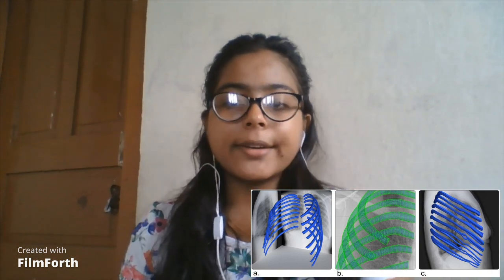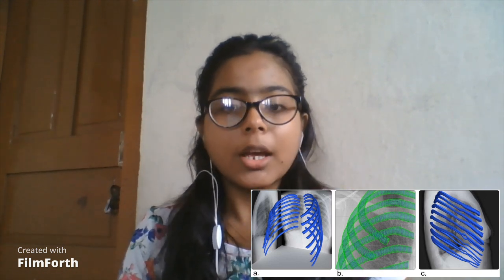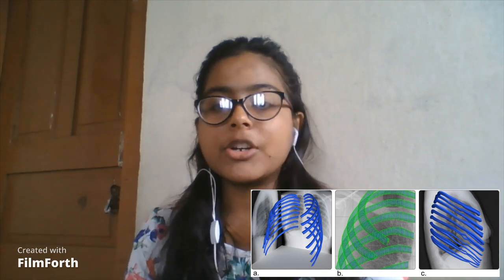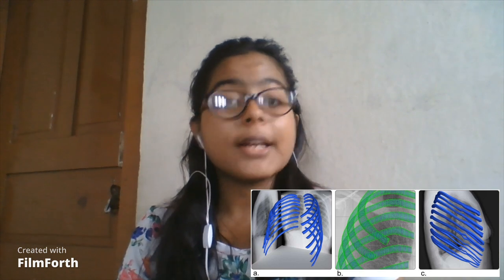The goal of the presented methodology is to get a good 3D approximation whose projection aligns with the segmented ribs in the PA X-ray image. A 3D scanner output is not available.